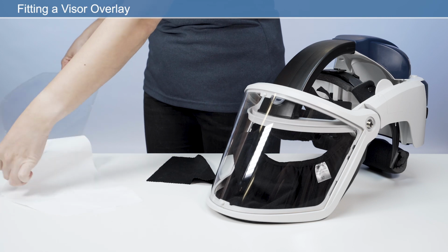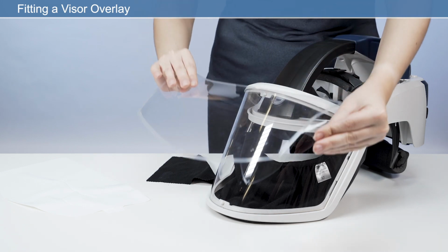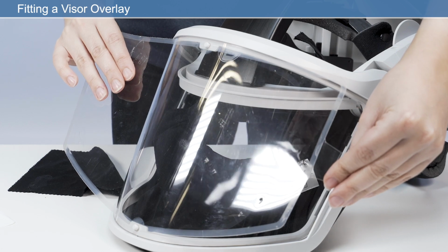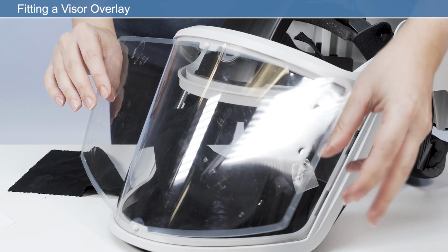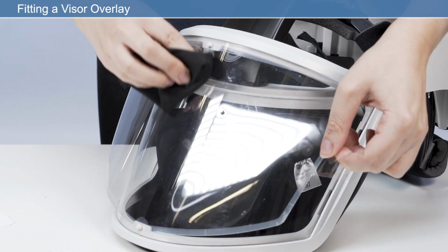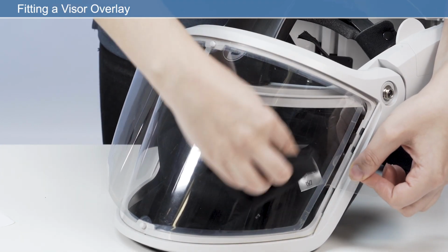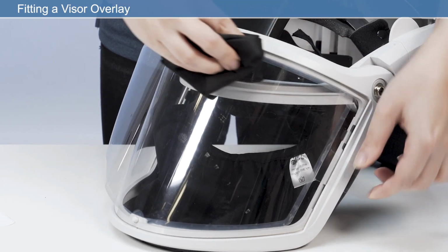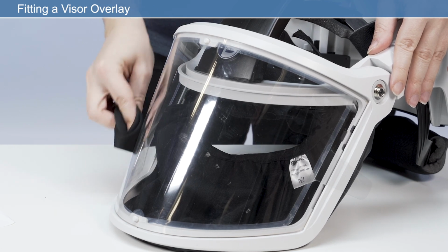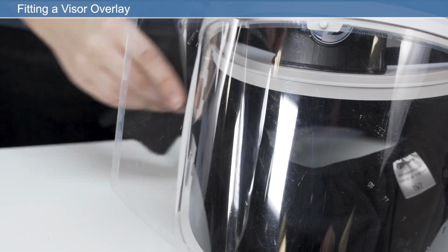Position the visor overlay over the PureFlo 3000 visor. Align the notch at the top and the bottom of the visor overlay with the matching notches on the visor lens. Adhere the center of the visor overlay to the center of the visor lens. Starting from the center, smooth the visor overlay onto the visor lens on each side. If the visor overlay is not flat on the visor lens, peel back the affected portion of the visor overlay and reapply.